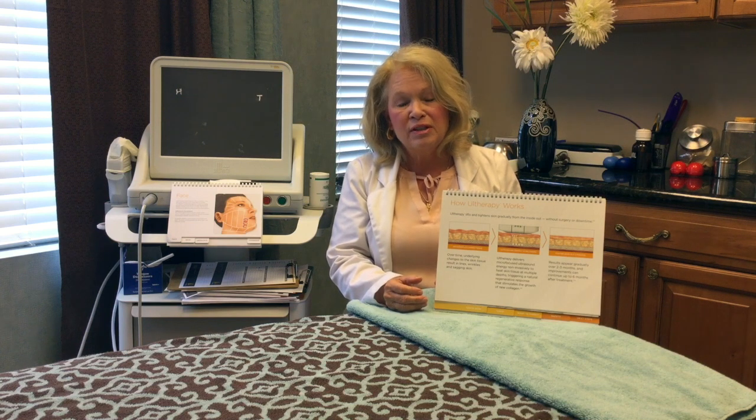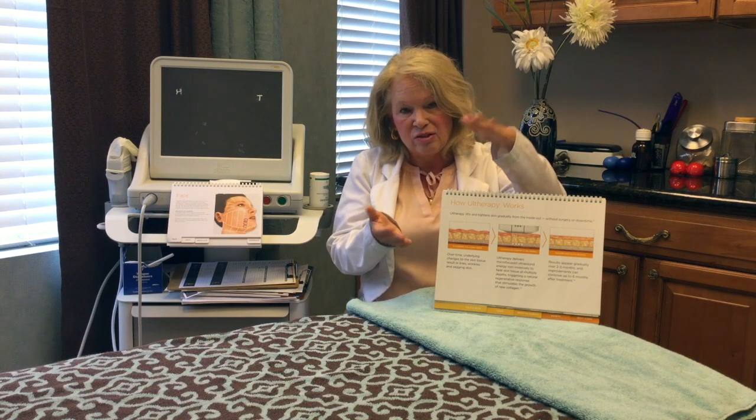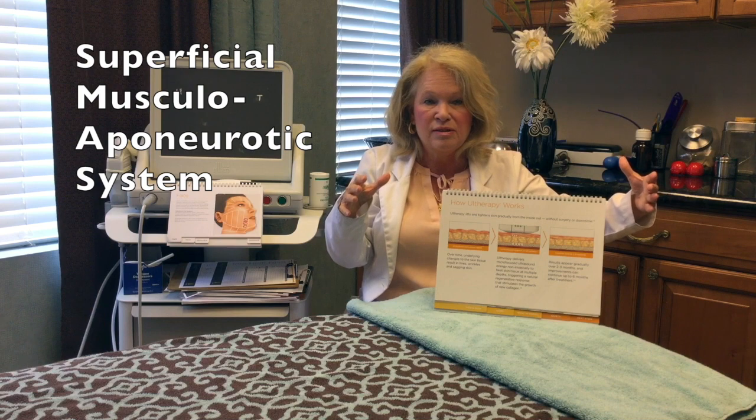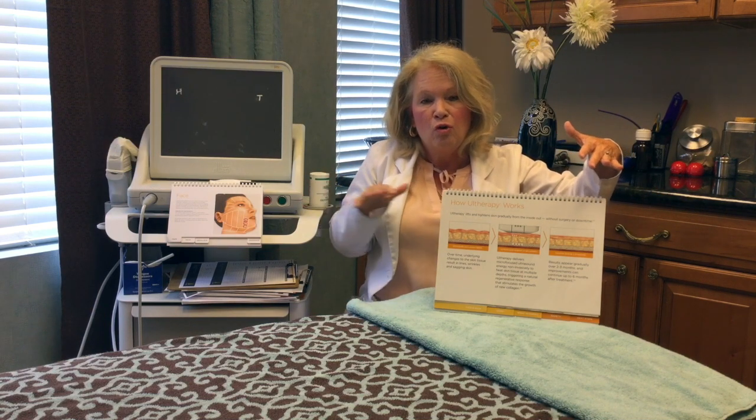to affect change. Specifically, we first have the Ultherapy machine and its transducer in position, and we can see where the dermis of the skin is, which is where collagen and elastin are made, and where the subcutaneous layer of the skin is, which is where the fat lives. Deep to the skin layers, we have a layer of connective tissue referred to as SMAS, the superficial muscular aponeurotic system, which is a condensation of coverings over whole muscles and muscle groups in the tissue. When we do a surgical facelift or a neck lift, we actually target this SMAS, because if we find it and either cut out a piece and cinch together what's left, or pleat it up, we can bring all of the underlying tissue of the muscle upward, lift it, attach it and anchor it. For instance, in the temple area, or behind the ears for a neck lift.